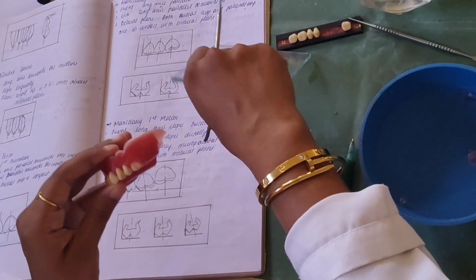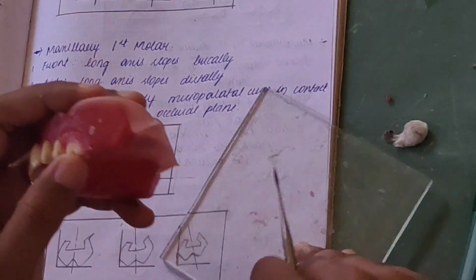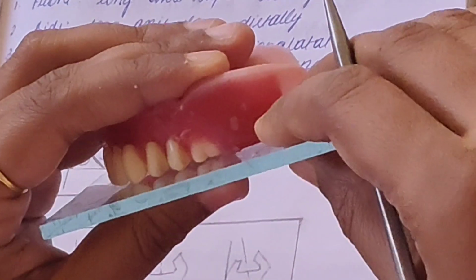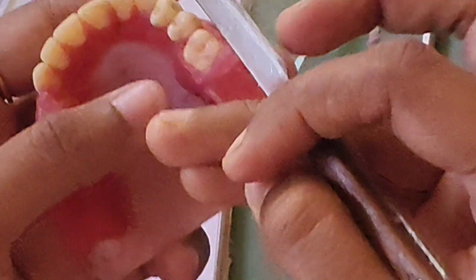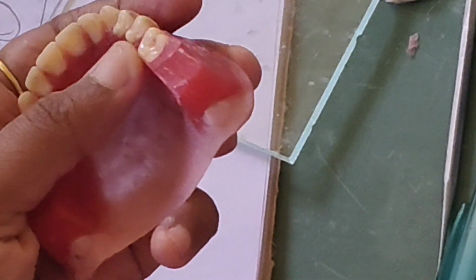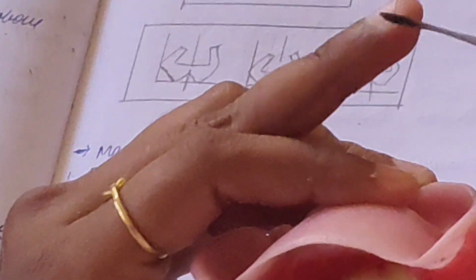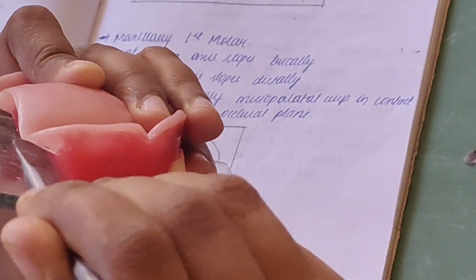Okay, so here this is slightly tilted. Then the palatal cusp is not prominent for now. How we will make it that prominent, I'll show you. This tip I will put, and I will bring that cusp down so that it touches.